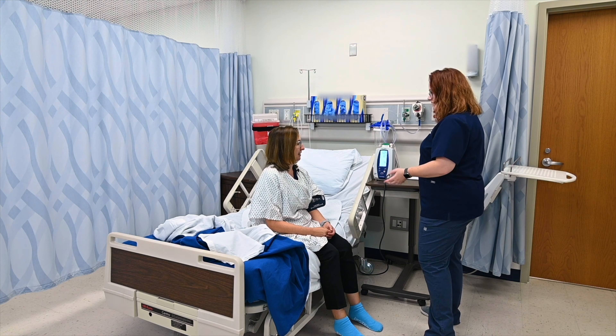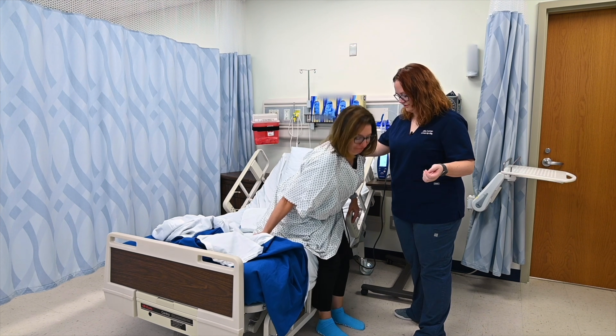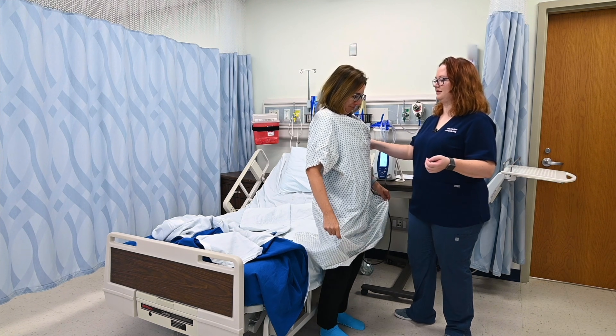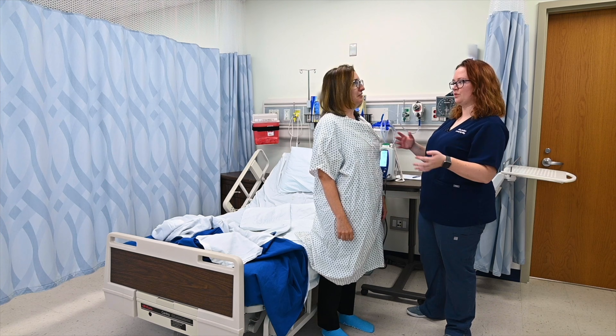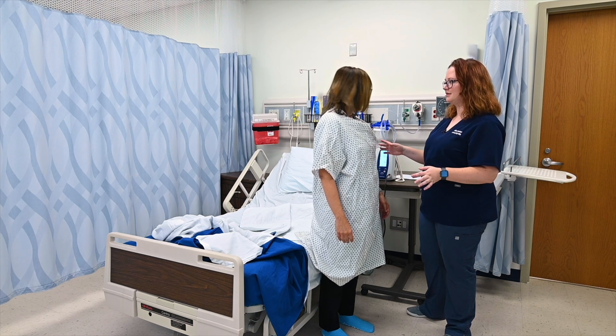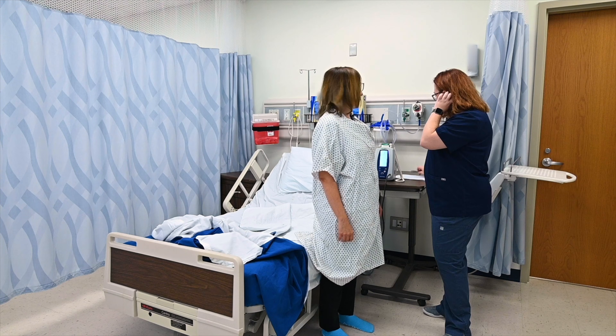We'll go ahead and just stand up. You feel okay? Any excessive dizziness or weakness? I think I'm okay. If that happened, I would have you sit back down, but we'll have you stand for a few minutes and check that blood pressure and pulse one more time.